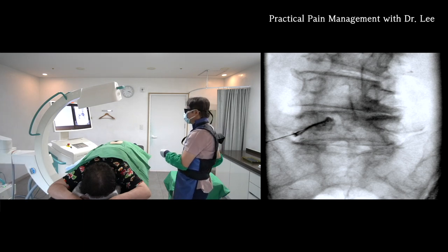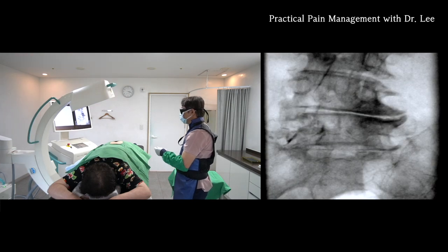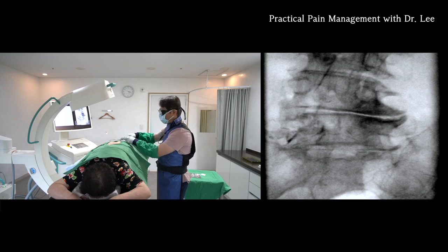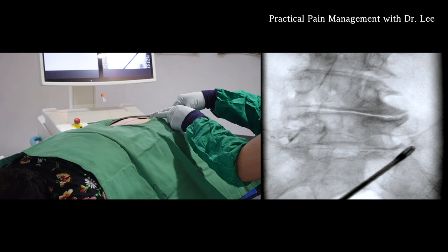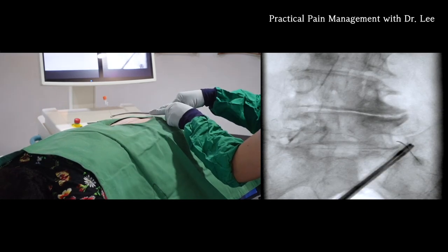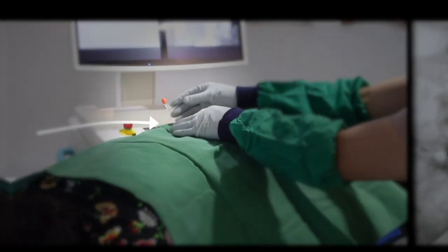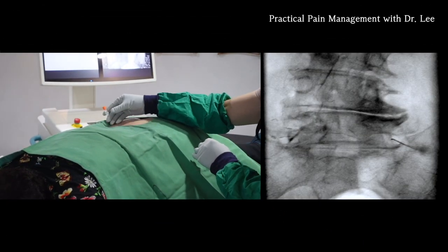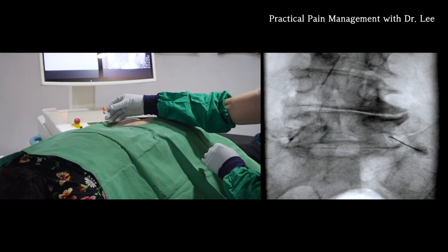Let me go to the right oblique view. If you look at the right oblique view, you will see that it will be flat. Look at the needle angle. Keep in mind that the right side is more challenging than the left side. Take out your hand during the x-ray.